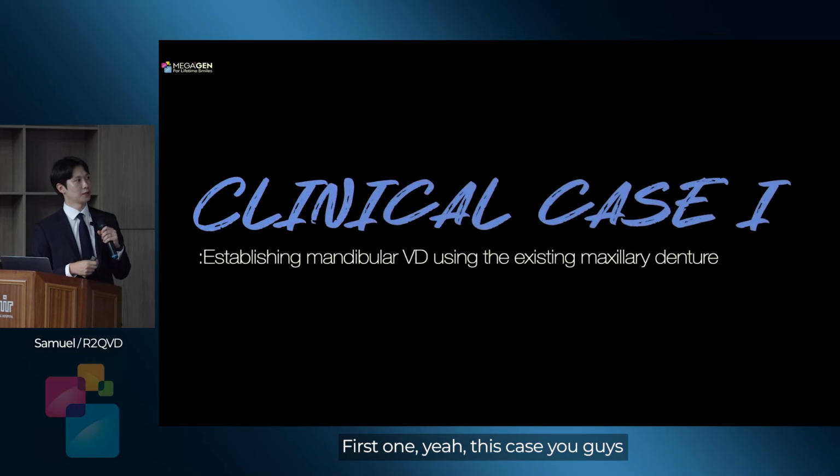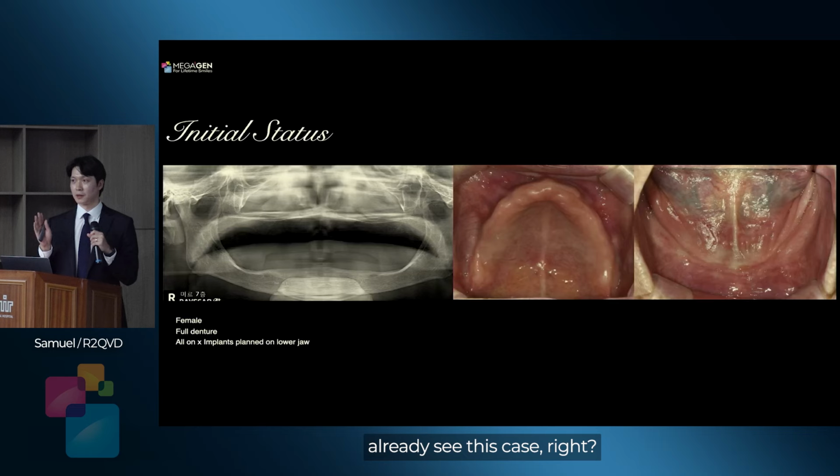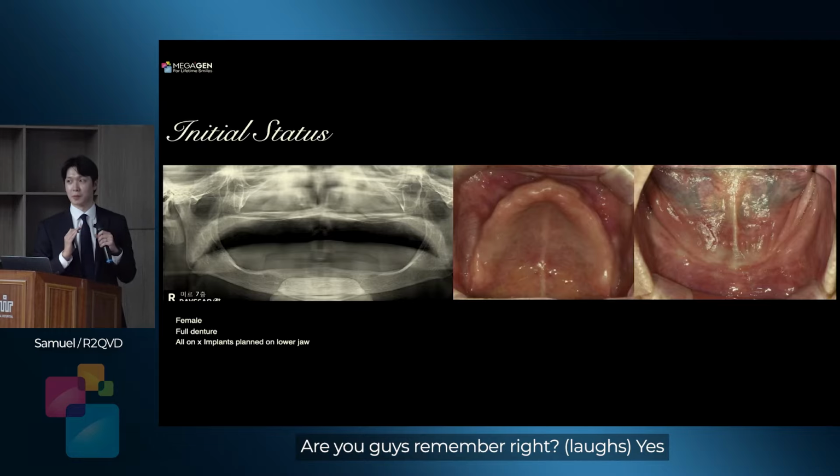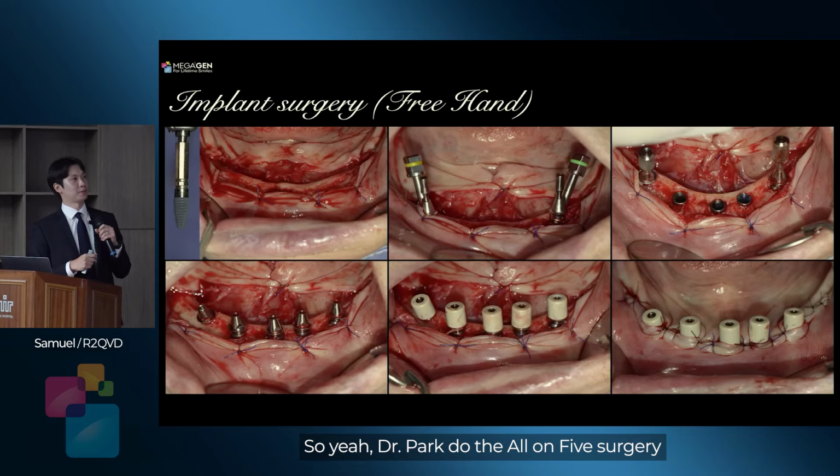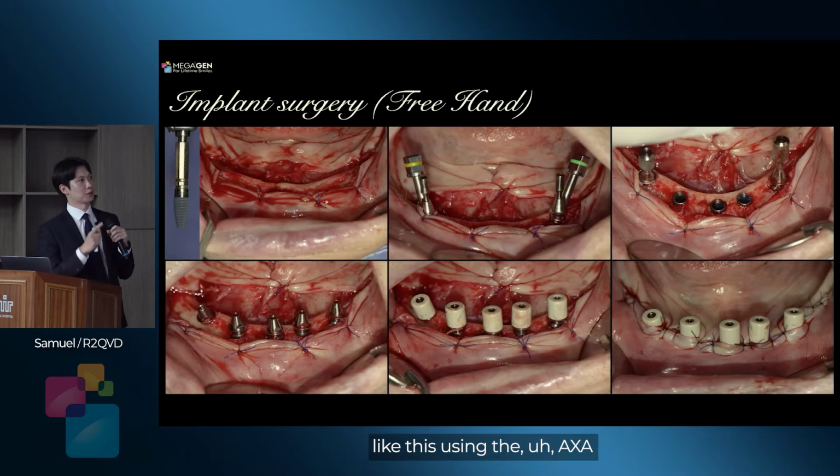First one, this case, you guys already saw this case, right? Do you remember? Yes. So, Dr. Park did the all-on-X surgery like this using the AXA.